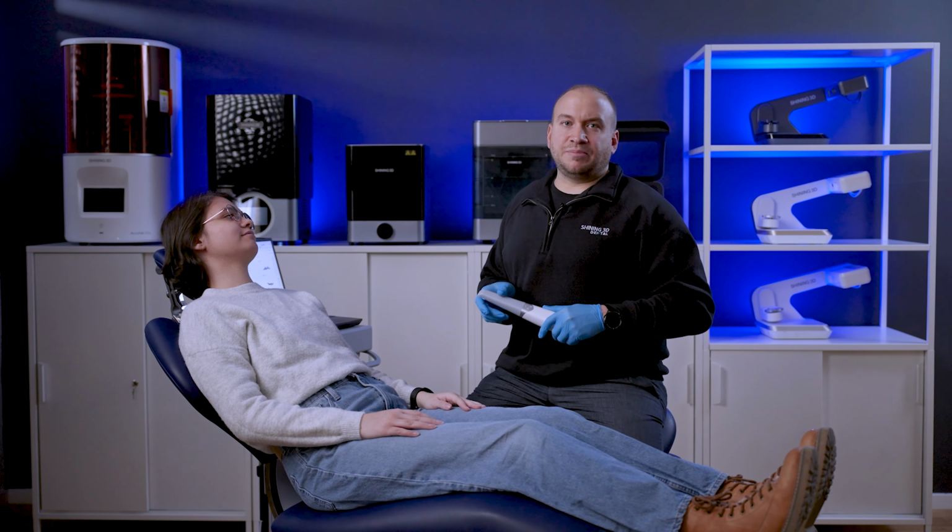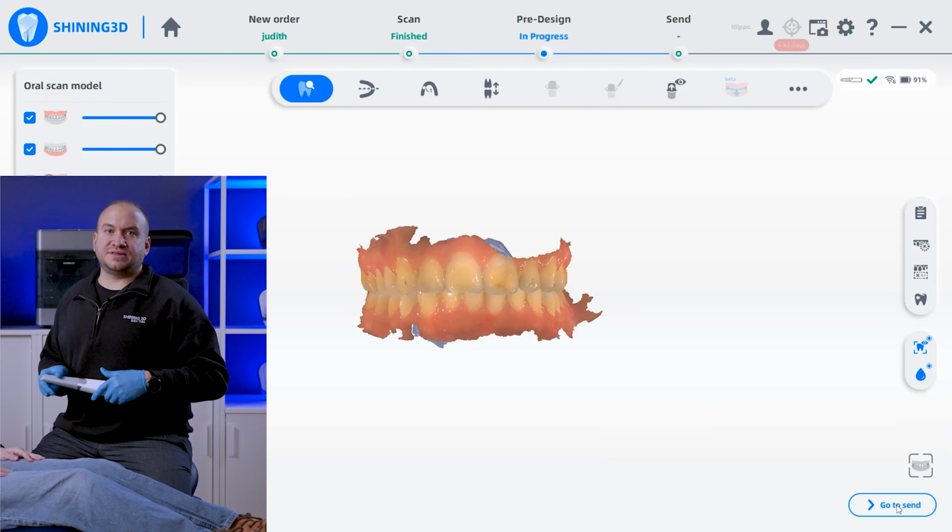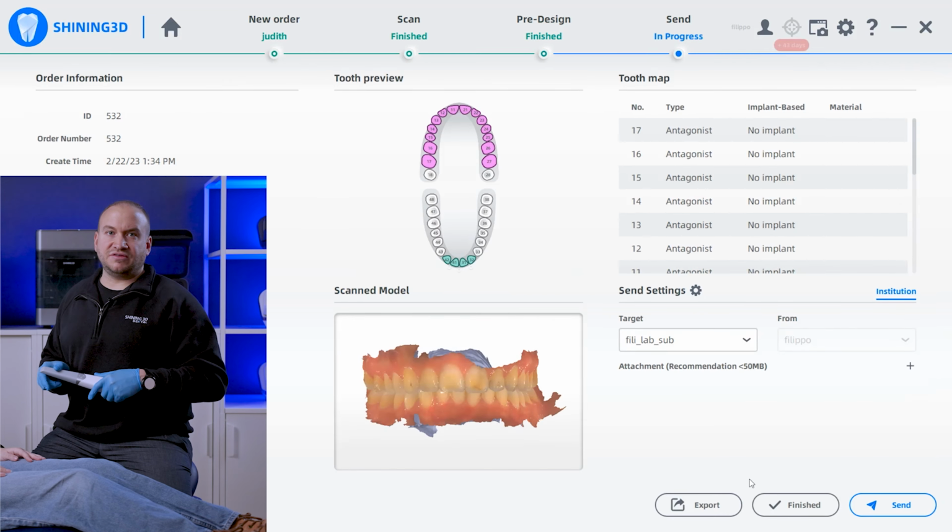And finally, let's upload the case on the cloud. As always, the doctor has the cloud option to send the file to the dental lab.